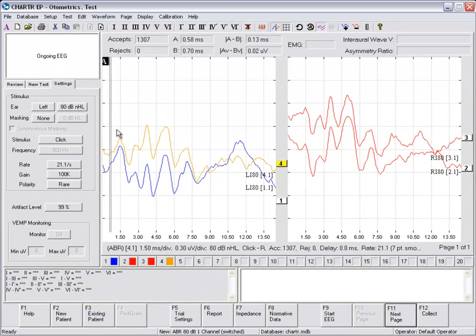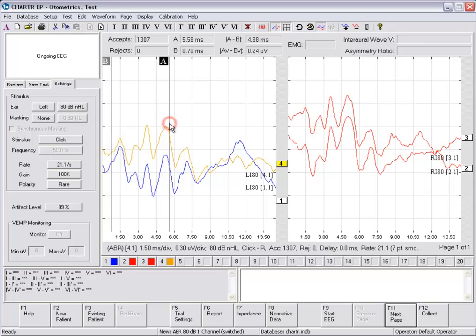To mark a waveform, place your cursor in the area that you'd like to place the marker. You can use your arrow keys as well.